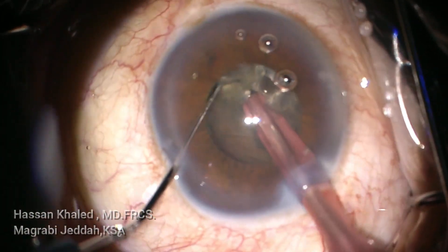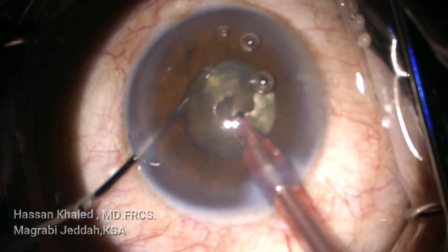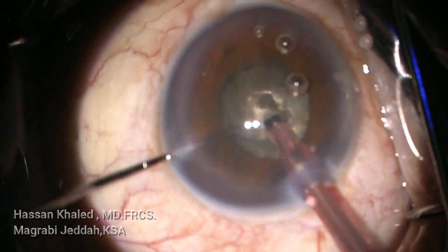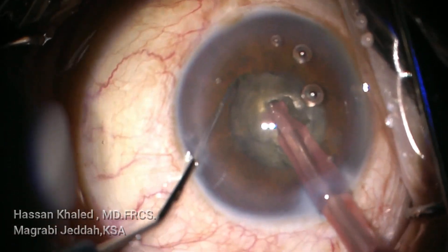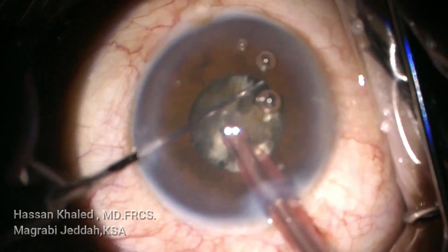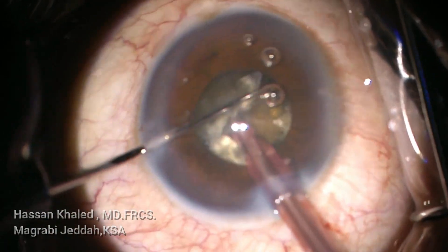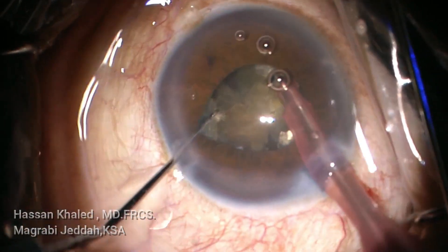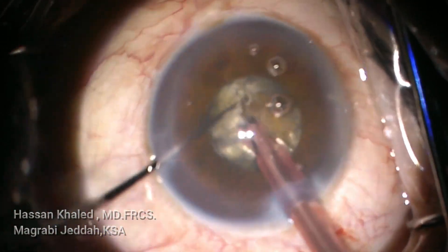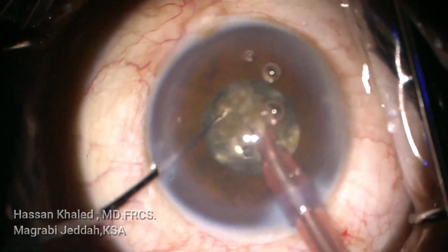You can see the chopping is not complete in this dense cataract — repeat again and again and rotate the nucleus. Impale the phaco tip in this dense nucleus and try to chop it. You can see now the chopping at the center of the pupil, though not complete. You can still see the dense nuclear part, which is now being chopped.